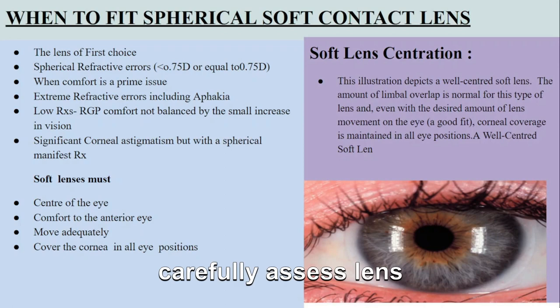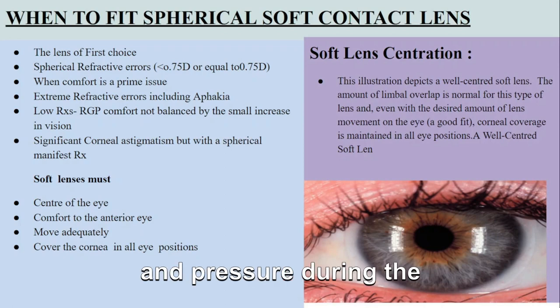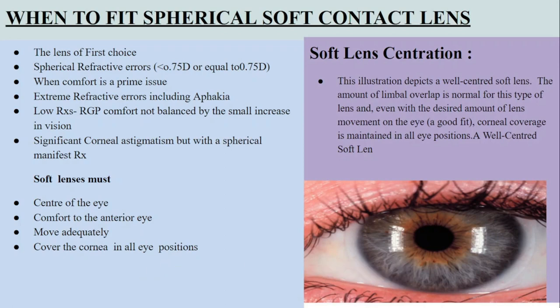Eye care professionals carefully assess lens centration during the fitting process to ensure that the lenses align properly on the eyes. They may use specialized instruments or perform a visual examination to check centration.